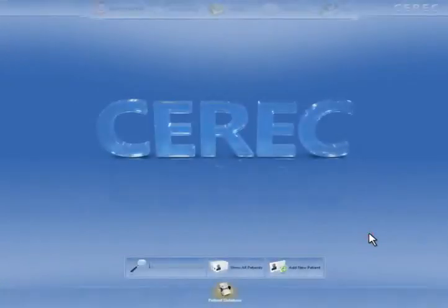This video is for internal demonstration purposes only. CEREC scans are normally always taken directly in the patient's mouth.